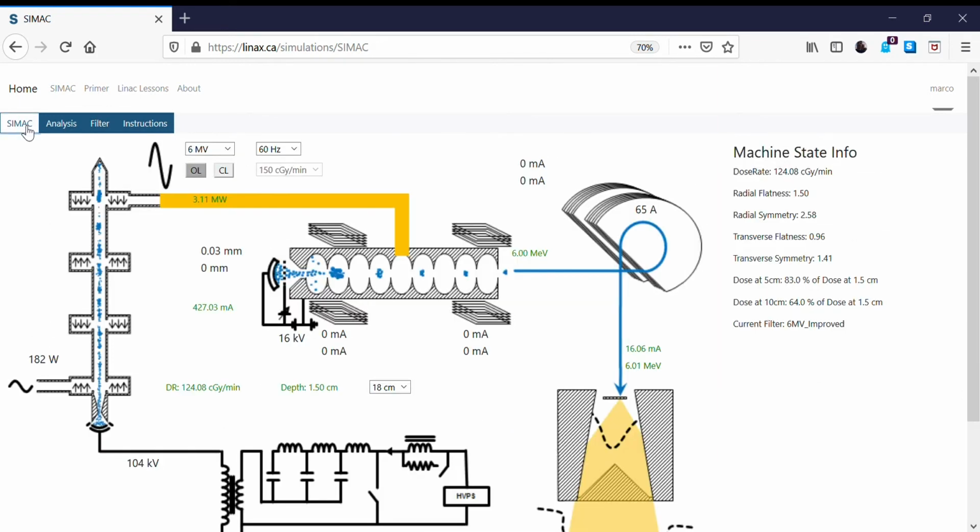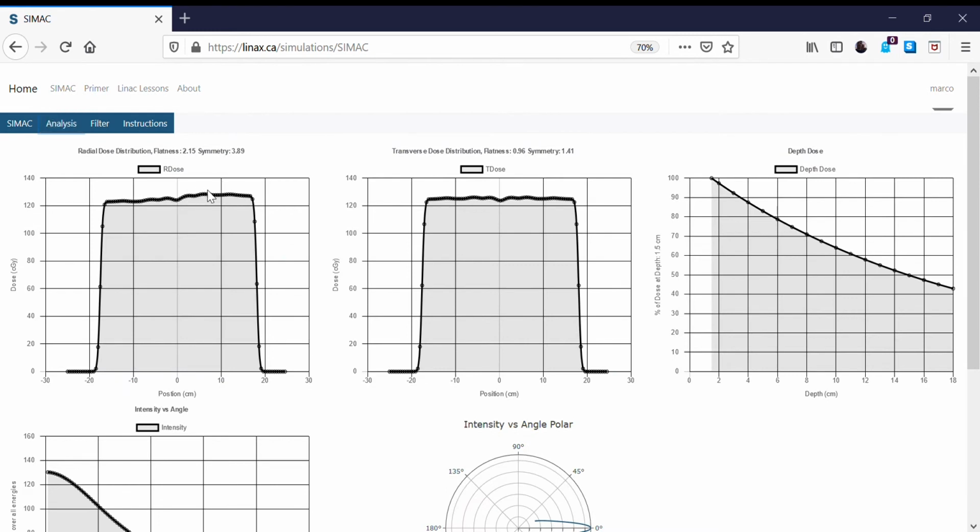We can make that even bigger by increasing this a little bit further, and now we can see that effect amplified. So now we have a beam which is unflat. SIMAC also calculates the value for symmetry, and the value of symmetry is 3.89. It does this by essentially comparing this side of the beam versus that side of the beam, using a standard symmetry calculation that's used for most symmetry measurements on clinical linear accelerators. So this is the value that we'd like to improve.